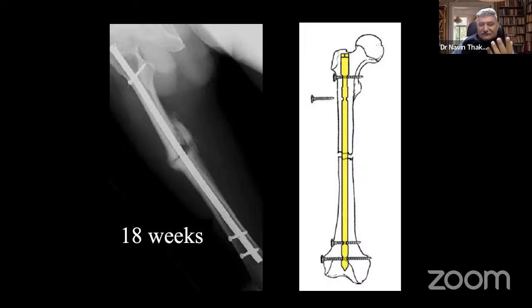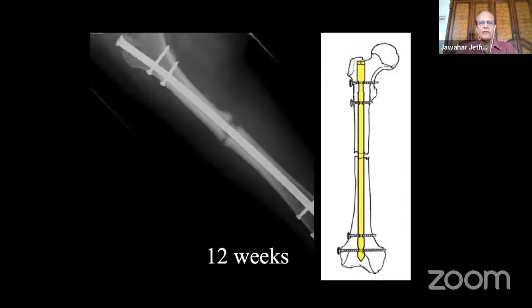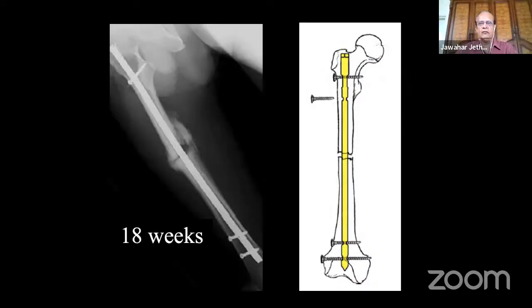Any taker? Dr. Jawahar bhai, how is the patient feeling? Is the patient feeling more pain, or is he feeling that yes, things are happening? After dynamization, he is feeling better. Little better. So one thing is very clear, that dynamization means excursion of the nail.